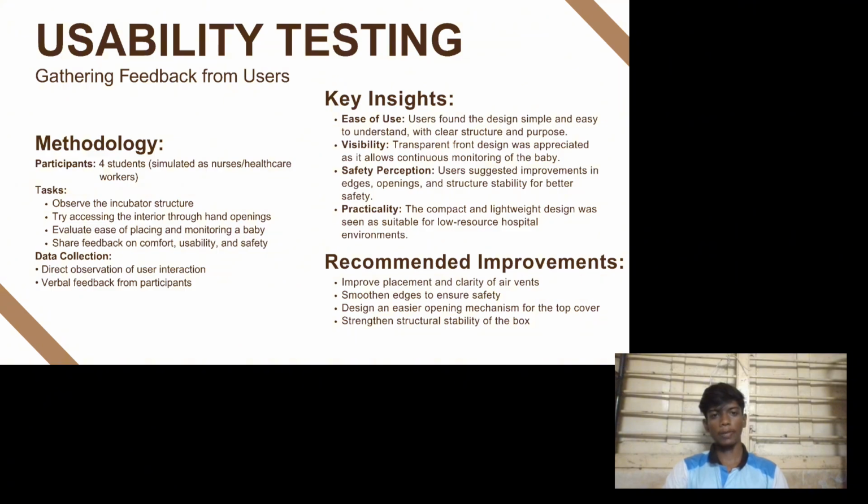Hello everyone, I am Prajin. Now I am going to explain usability testing, which is mainly about gathering feedback from users. So first, what is usability testing? It is a method where we check how easy and safe a product is by asking real users to try it and give feedback. In our case, we tested a baby incubator design.